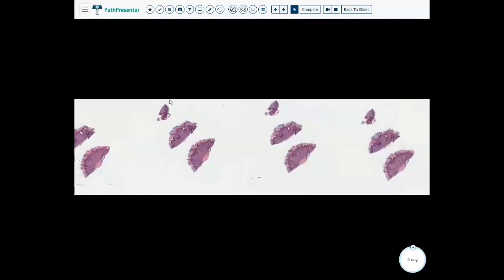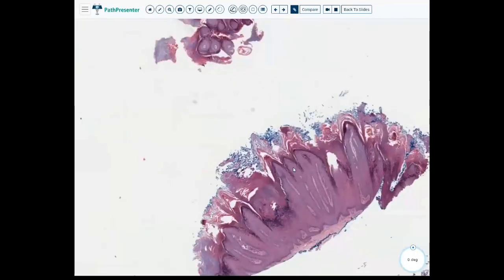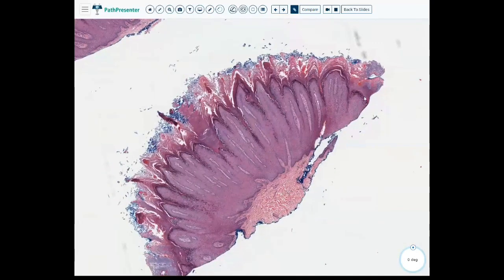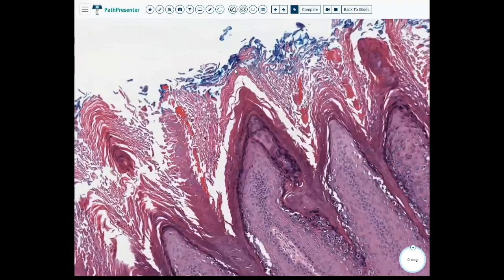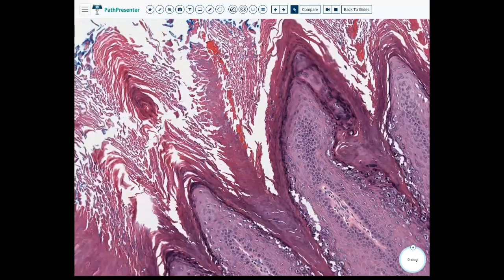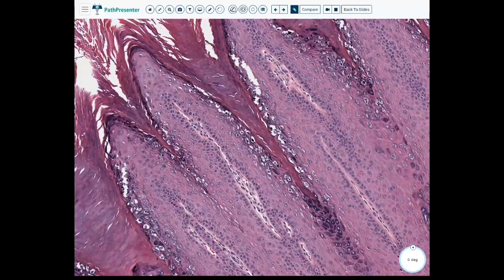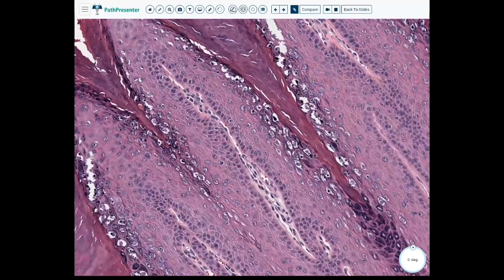Case five. We have multiple cuts of the same tissue. Here we see more classic — here's this papillary architecture. We have a little bit of intoeing where it looks like it's being pulled towards the center of the lesion. It looks like we have steepling — and we do. You can see how we have this layering of the parakeratosis over top of these papillary areas. We have intracorneal hemorrhage.